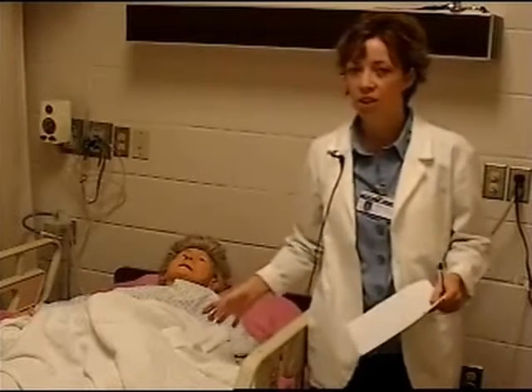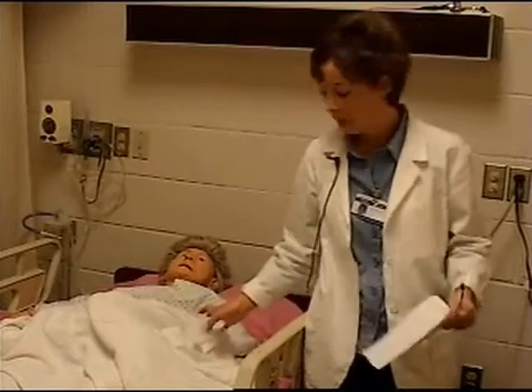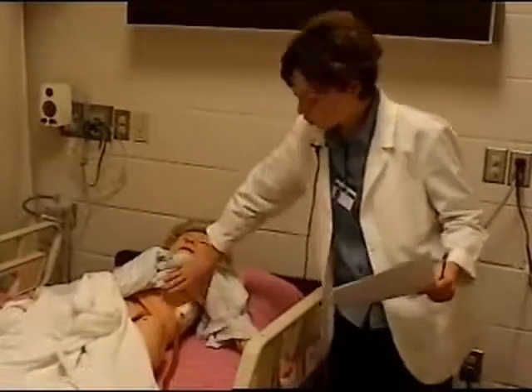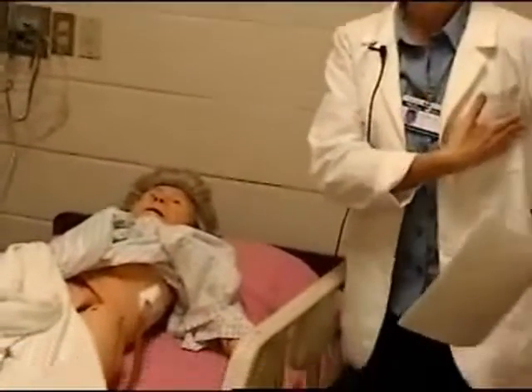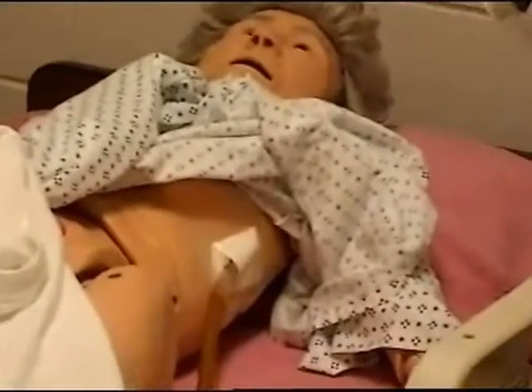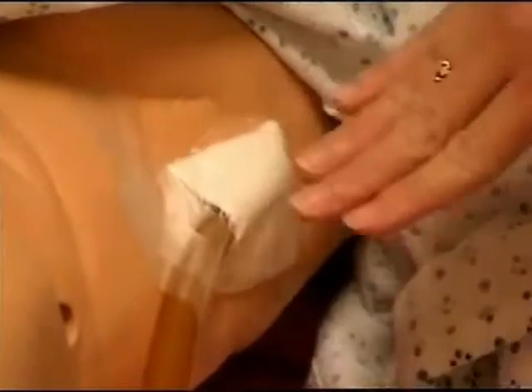When a chest tube is initially put in, it should be evaluated and the patient should be evaluated every hour. There will be an occlusive dressing of some kind. Usually it's like an op-site, and they cover like an ABD, and then sometimes there's even tape. We have some 3M surgical tape that'll be placed over top of that. And it's very important that this occlusive dressing stays intact. If at any time it doesn't, you need to have the supplies in the room to immediately put pressure on and cover that and get an RN in immediately.